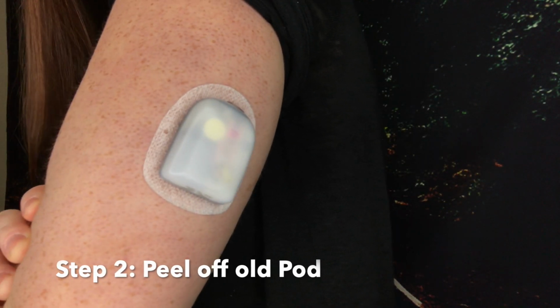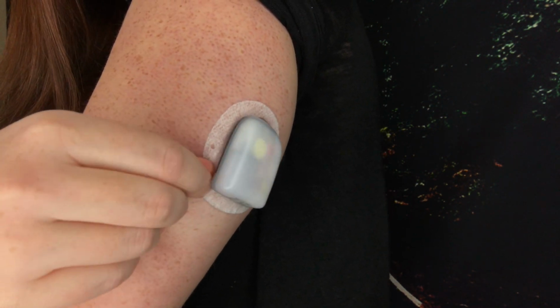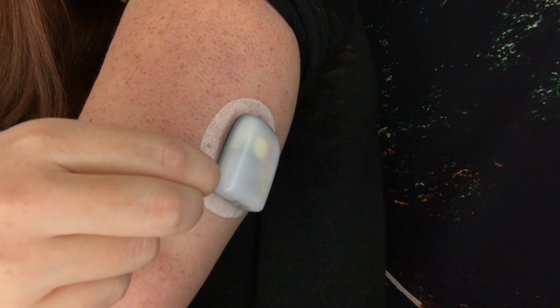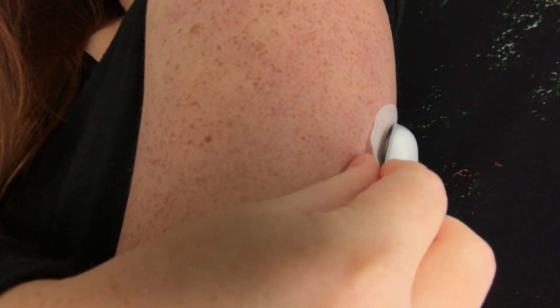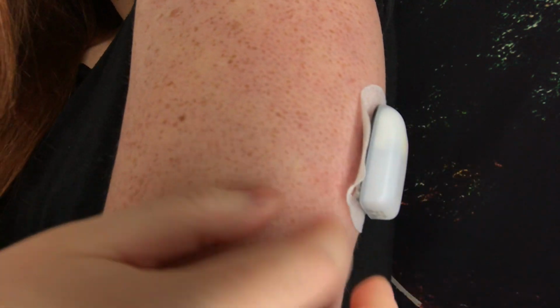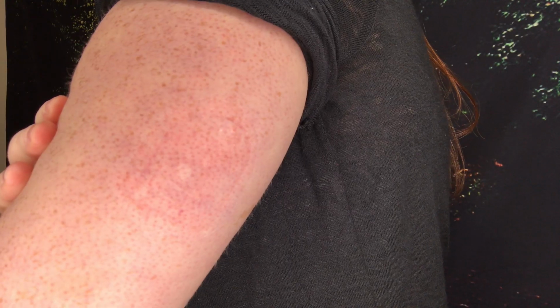Pulling the pod off is like pulling off a band-aid. So if you stick it on a really hairy part of your body, it's going to hurt a little bit. I like to pick out a little spot on the underside of the pump just so that it doesn't feel wonky when I pull it off, because if you pull it by the top, the cannula feels a little weird. Yeah, that little guy. But it peels right off, and then just wipe it down with alcohol and you're good to go.